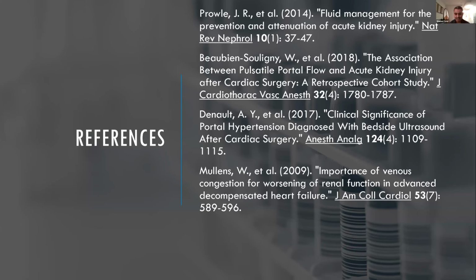And my second question is, how do you come around confounders like obstructions, something like Budd-Chiari or some sort of obstructive picture in the inferior vena cava, or severe pulmonary hypertension? How do you remove those as biases to the pictures that you've seen?